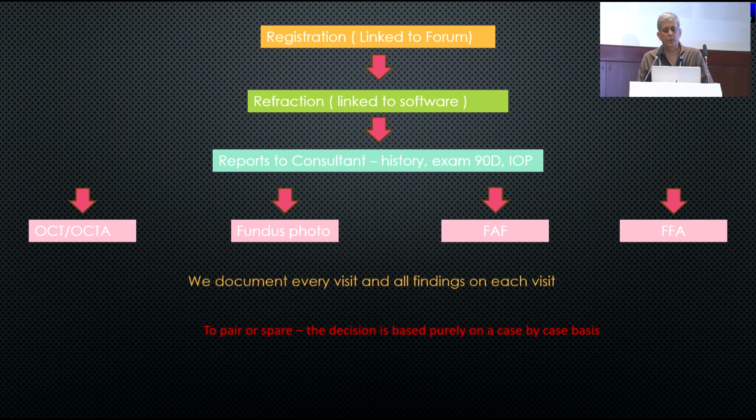And we first and foremost register the patient. All our registration is linked to Forum. Forum is a software provided by Zeiss and allows us that once the registration is done, each technician does not have to re-enter the data again and again into different machines, which is upsetting for both the patient as well as for the technician. It takes up more and more time. Subsequent to that, the patient is immediately shifted to a refraction. If the patient is not improvable to 6x6, the consultant is called in and we start the dilation process right there so that the patient doesn't have to wait to be started.